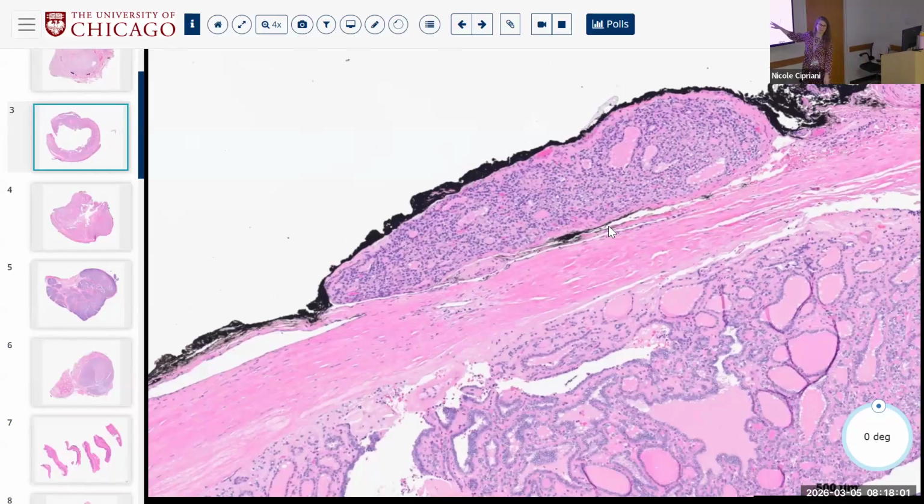The RAS immunostain, right, if you have a tumor that you know is RAS mutated, or even if you don't know, throwing the stain on, and if you have one positive and one negative, right, that can help you say that they're different tumors, right, that one is RAS driven and one is not. I've seen that being used in other institutions very usefully. We don't have it yet. We don't have that stain yet, but that's been used in that manner.